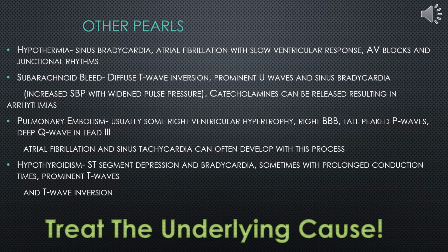Hypothermia, this could be from an exposure like near drowning or prolonged exposure to cold temperatures, but a lot of times, especially in the hospital setting, these could be therapeutic in nature, such as a patient that's status post-cardiac arrest. But you might see these kind of changes with hypothermia, and that may be expected. It may be something worth notifying to a cardiologist, but if a patient is in the ICU, they're being managed by a critical care provider anyway.